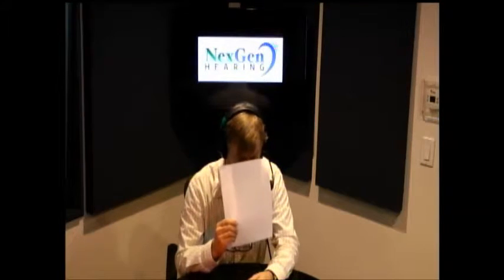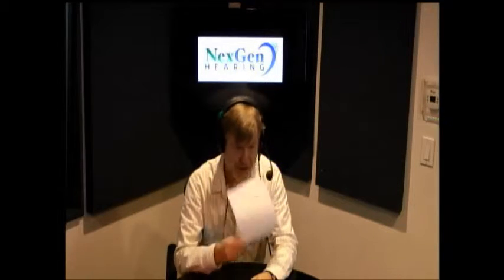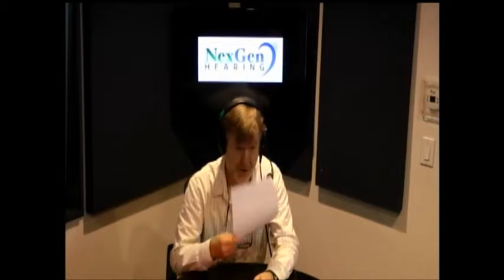Say the word church. Say the word cow. Say the word love, or say the word death. Did you see deaf or death? Yeah, okay. Exactly. So you're testing the clarity of one's hearing. Okay. And so it's a whole procedure.